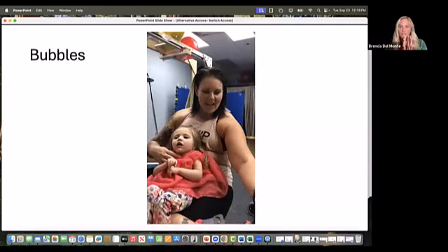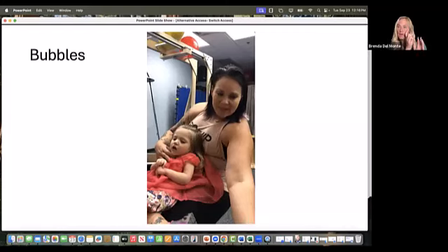She also uses switches. We put the switch about that 1 inch so that she can move her head a little bit without hitting a switch. And when she does hit a switch, we don't wonder if she meant to hit it because it was so close to her head. So that placement, once you figure out how far their range of motion is, you want to put it just far enough where when she does it, it's intentional.